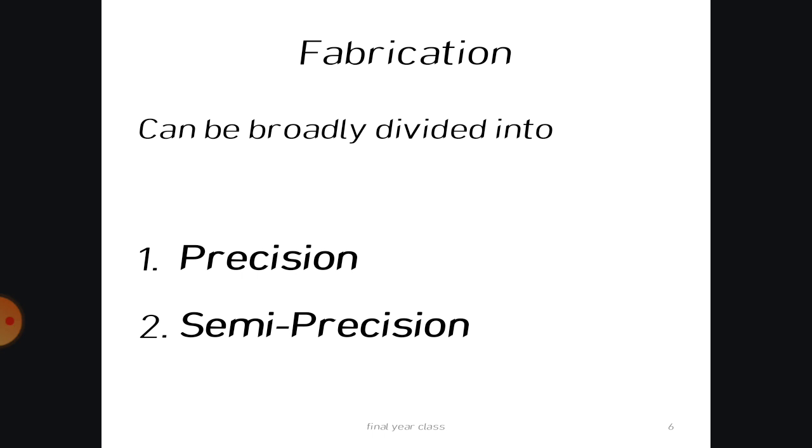So these are the broad classifications based on fabrication, that is precision and semi-precision. Precision is machined components, and semi-precision is the components you are casting from plastic or wax patterns.